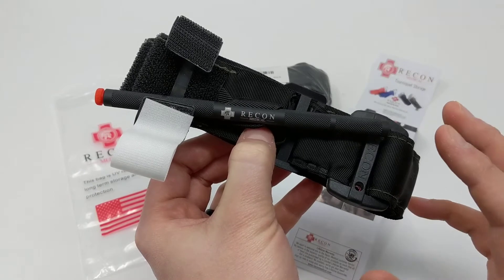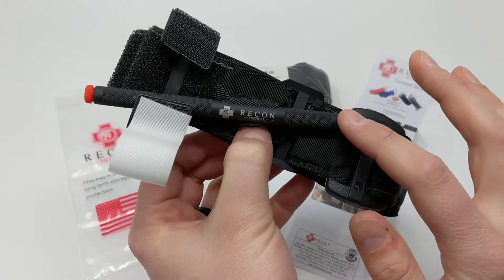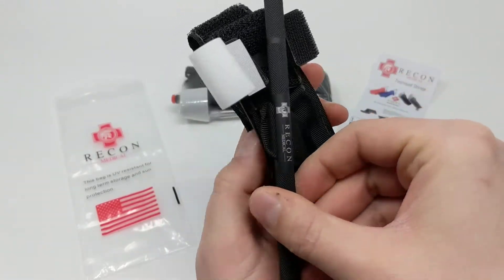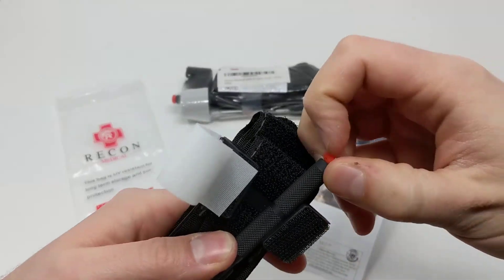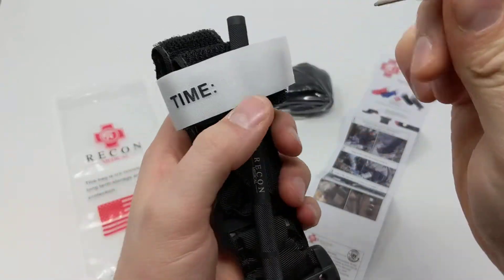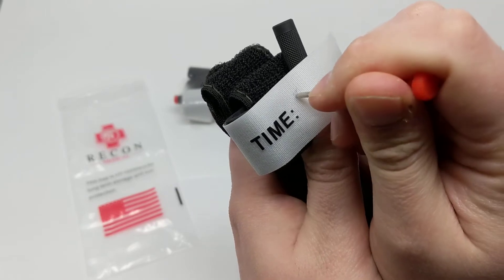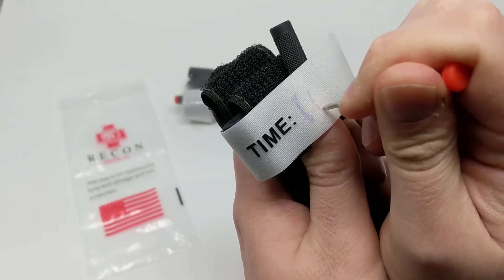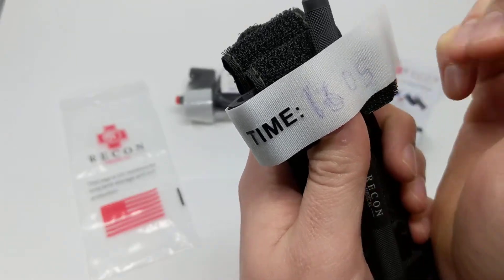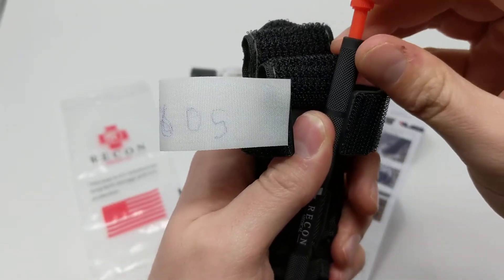Some of the features that make it impressive are the high-quality aircraft-grade aluminum windlass that's nice and grippy here, so you can grab it even with wet fingers. They've done some innovative features like right in the windlass — actually built in a pen — so this pen comes out and you can actually write the time of tourniquet application right on it. It stores right in the windlass here.